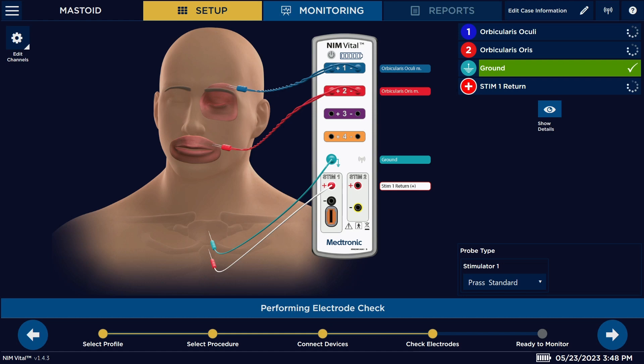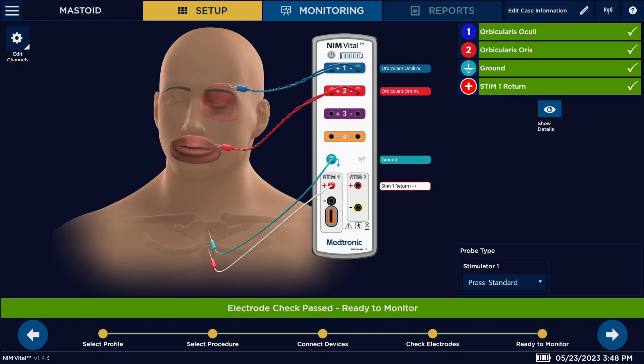For a mastoid, we're going to be monitoring the facial nerve, so we're going to be using facial electrodes. We're going to be placing the subdermal needle electrodes — one above the eye, one above the lip. We're also going to have our green electrode and return lead placed on the patient's sternum.